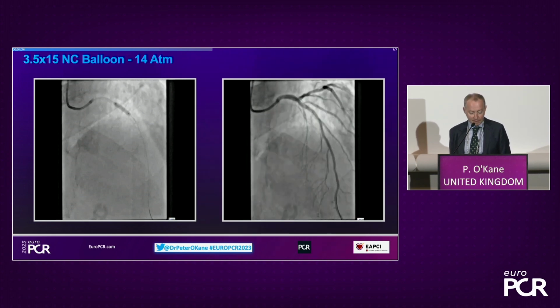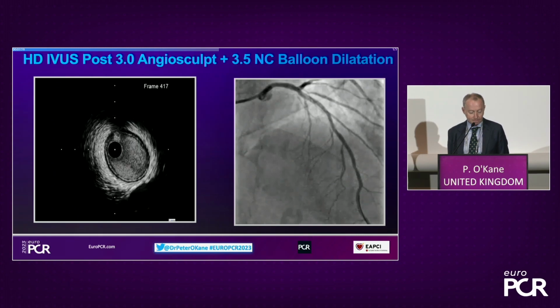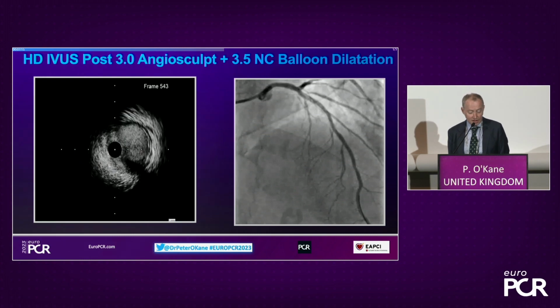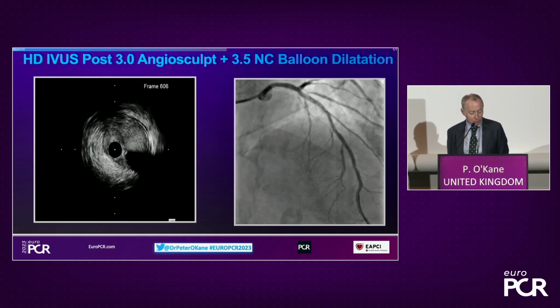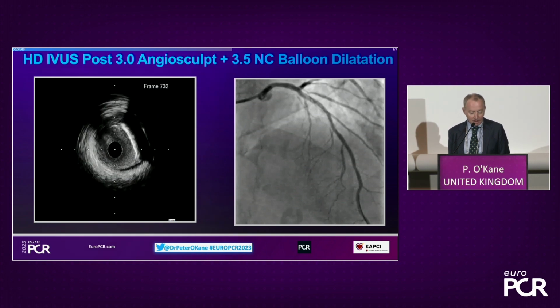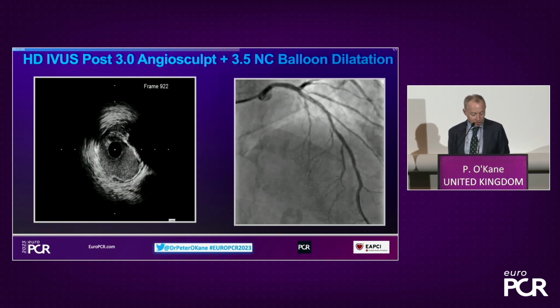And that's the angiographic appearance after that combination therapy. And again, to me, there's a bit of disruption there in the proximal vessel, but we're going to confirm that with some imaging. So here we are again, repeating the IVUS. None of this takes very long. It might be an extra minute or two, but it's worth it, I think, to get the information.